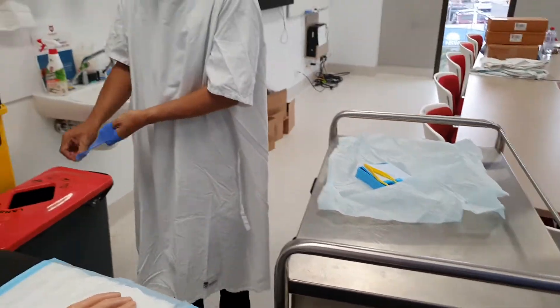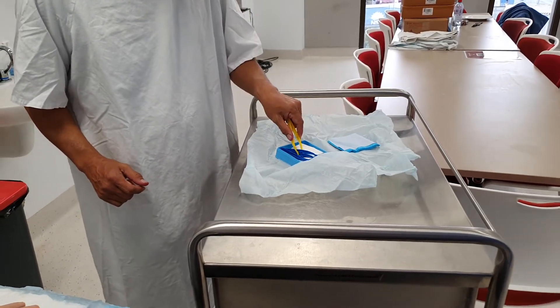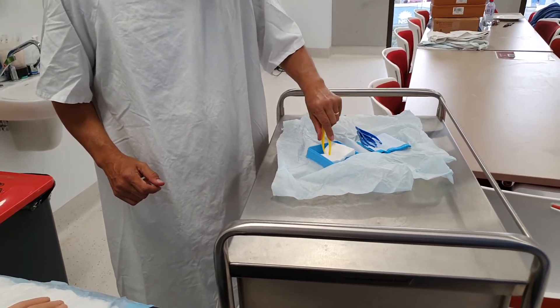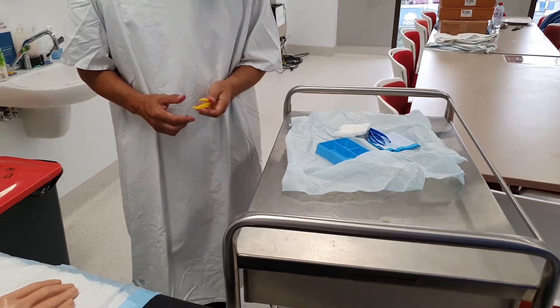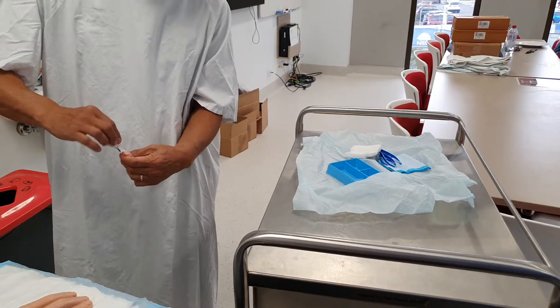With the dressing pack, I'm not really going to use anything in it other than the gauze once I've finished the procedure, but the dressing pack is going to give me a sterile area — a clean area where I can work from.